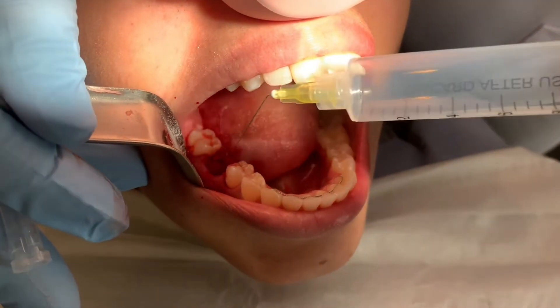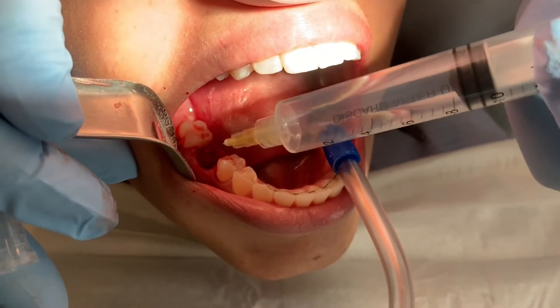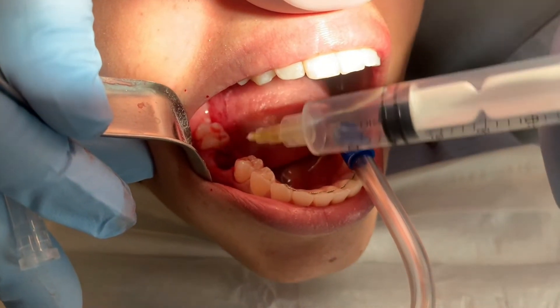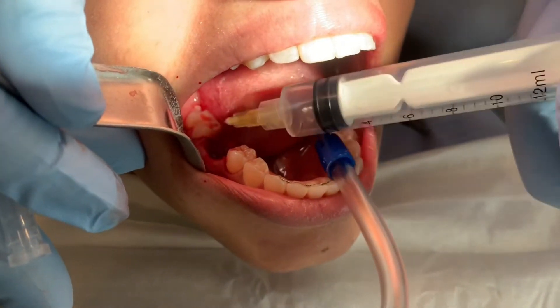This is the ozone and oxygen gas. We'll just bubble this down into the extraction site. You can see bubbles forming. There's not a lot of fluid, but there's a little bit — and that lets us know that this bone is alive and healthy.